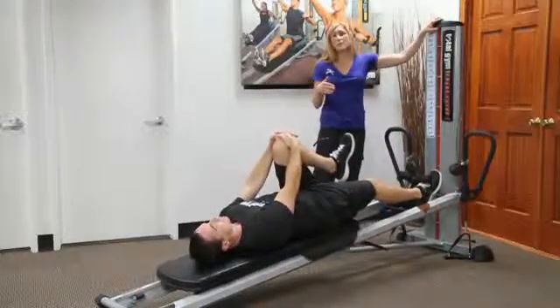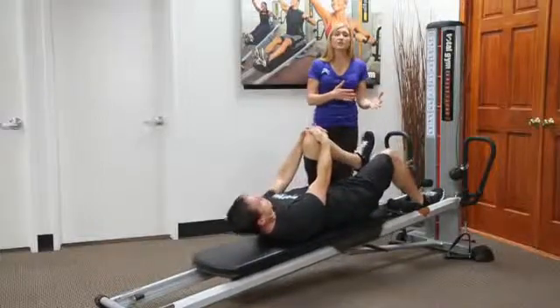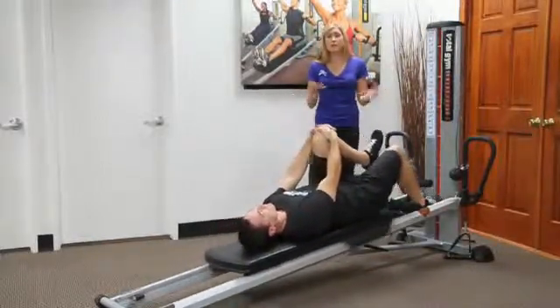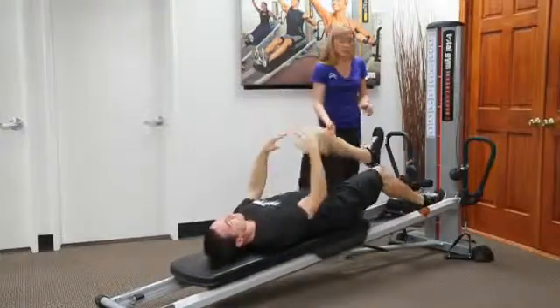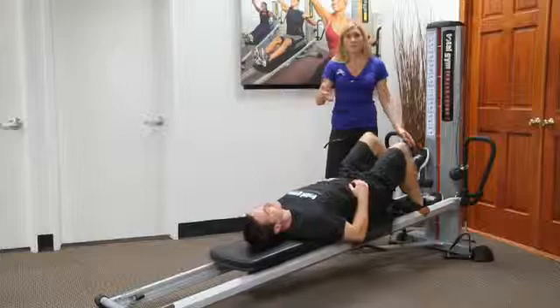Or if I'm working with a unit that I would have to transition the person off the machine and get them back onto the machine, an easy, simple way is to have the person self-spot, and that will decrease the amount of resistance. So in this case, he just puts his foot right on top, and now he can self-spot.